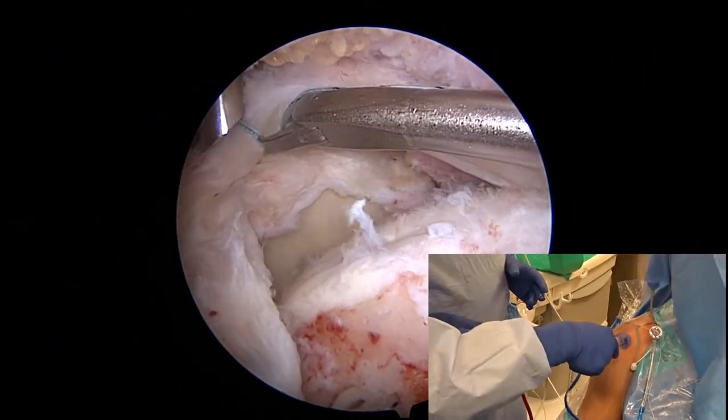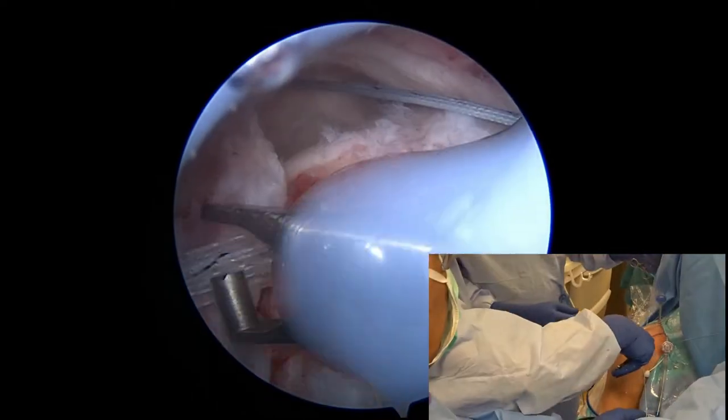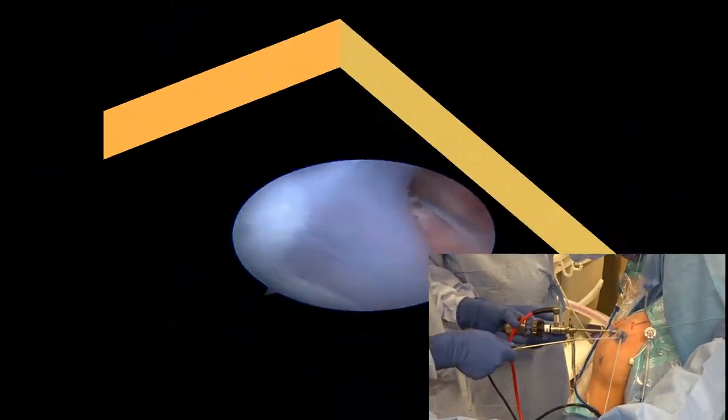The sutures are then brought out the passport cannula, one anchor set at a time. We recommend keeping the sutures separated into quadrants and applying tension to the suture limbs to decrease the chance of tangling the sutures.